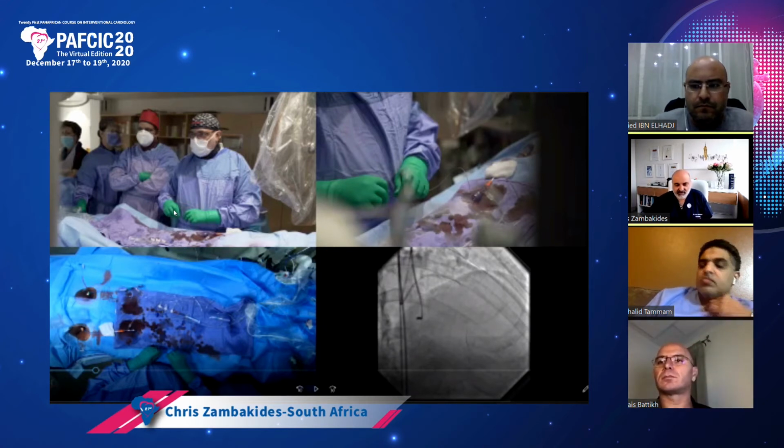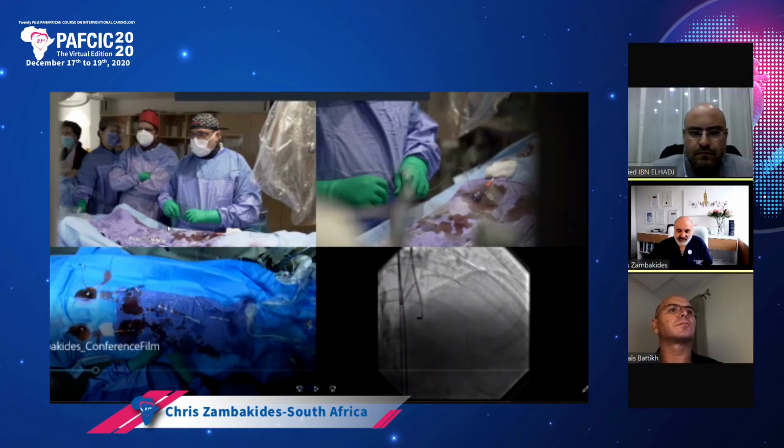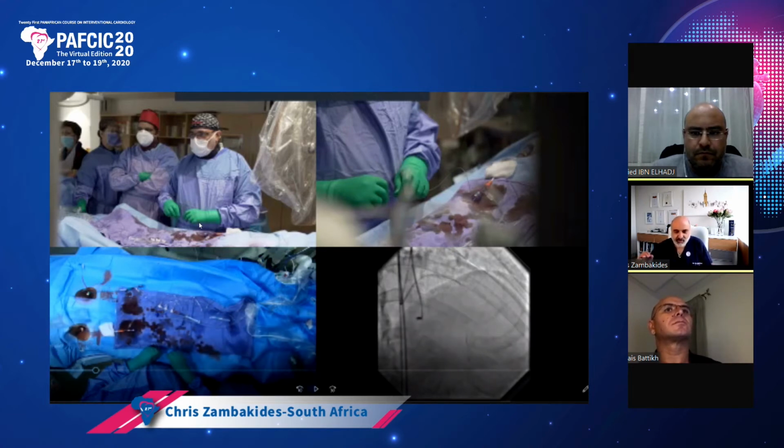So the mistake that a lot of the younger operators are making is that it's not an open vessel like we do before, where you point the wire and just push as hard as you can to try and get it down. It's all got to do with rotation. So I'm just going to let it run for 30 seconds to a minute, but please have a look and see the hands, and everyone rotates it in a different way. I hold it from the top down, others hold it in the palm of their hands, but as long as it is rotation of the wire and very little pushing.